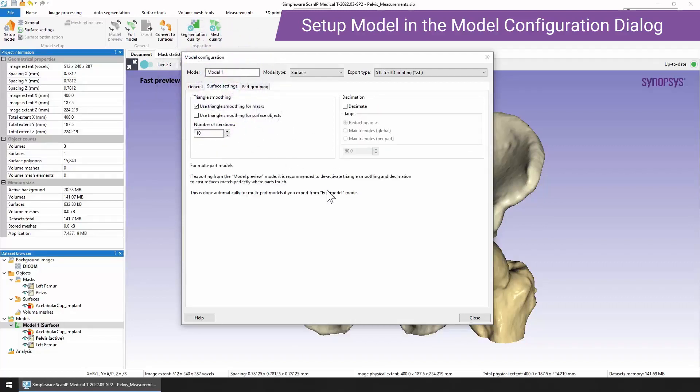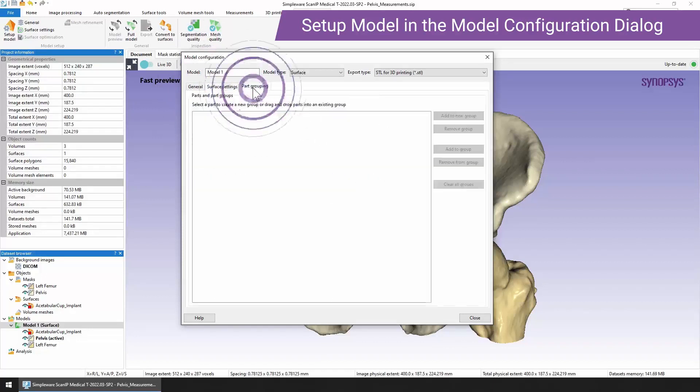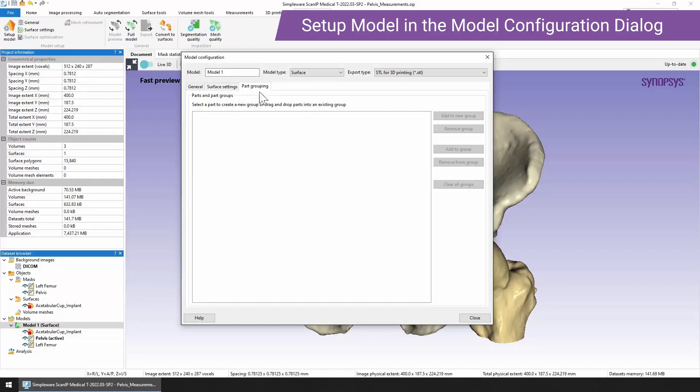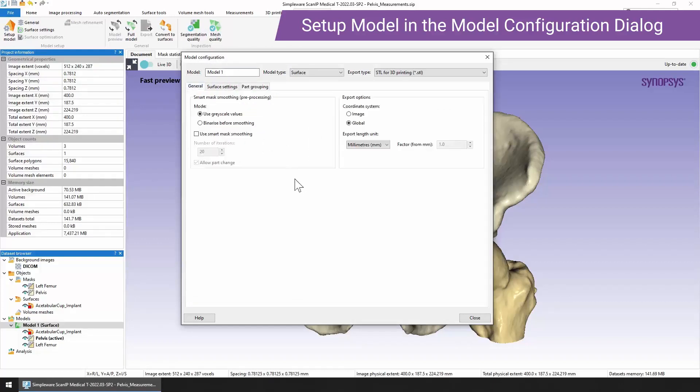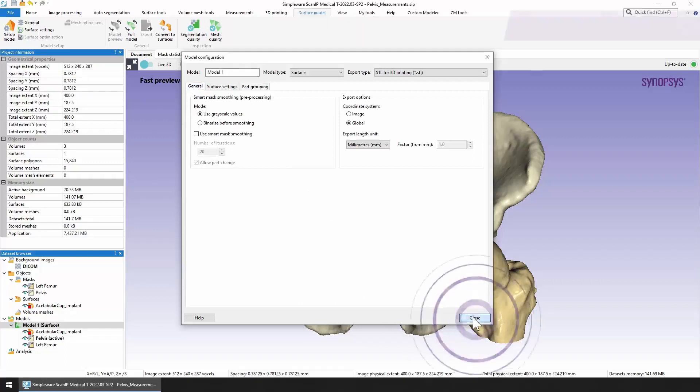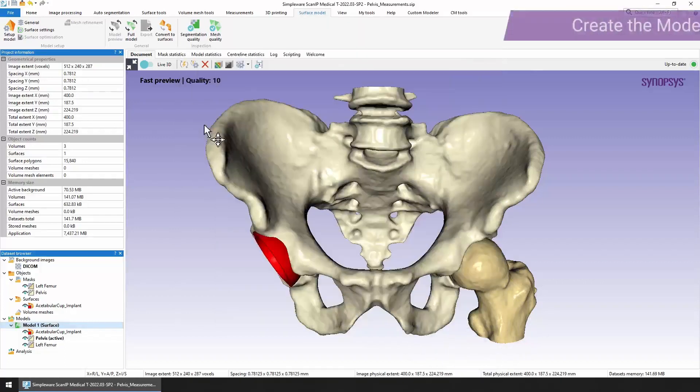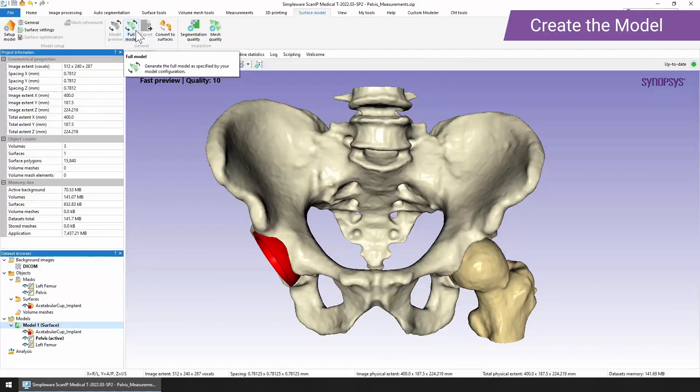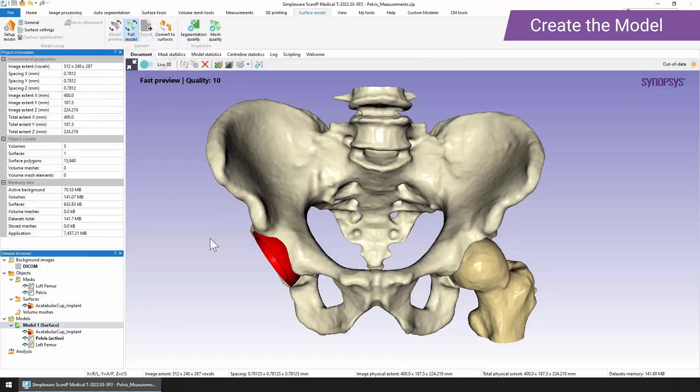If we look at the surface settings, again very simplistic for this particular type of STL. You can apply some simple triangle smoothing or some decimation if you wish. You can also use part grouping if you need to group different objects when you're working with them outside Simpleware ScanIP. Once you're ready you just click close and then you go to this tab at the top and just click full model.